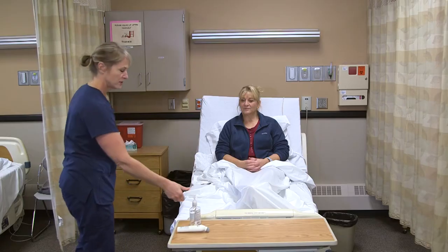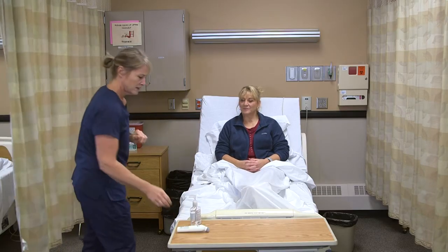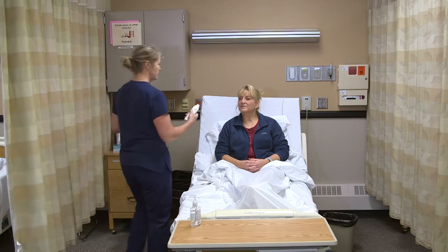To take a TPR — temperature, pulse, and respirations — on a resident, I just need the thermometer to do the temperature. I'm going to knock on the resident's door, wash my hands, and greet them: 'Hi Annie, I'm here to take your vitals, is that okay?' Then I'll provide for privacy and we'll start with the temperature.